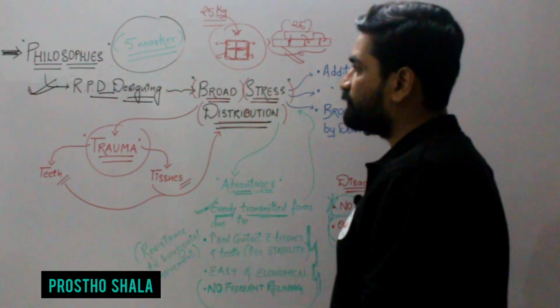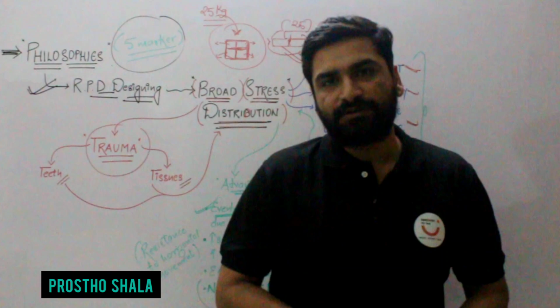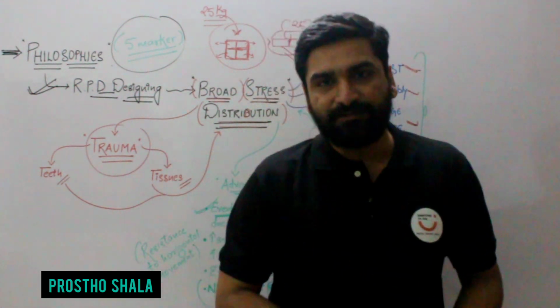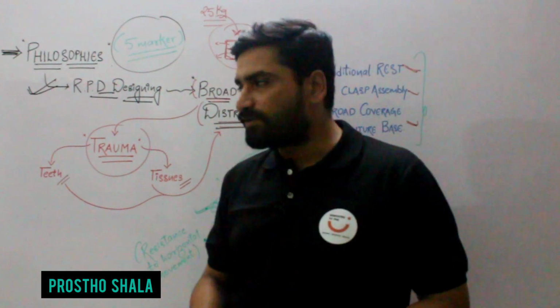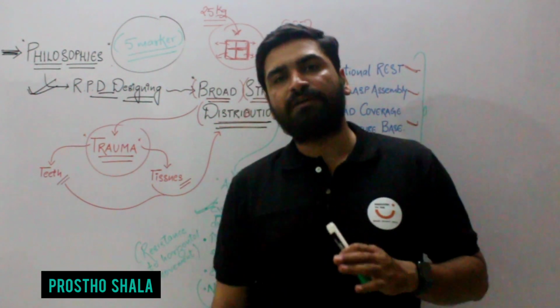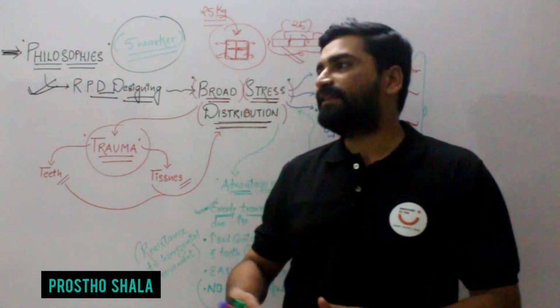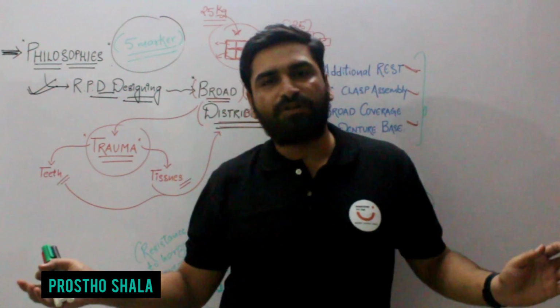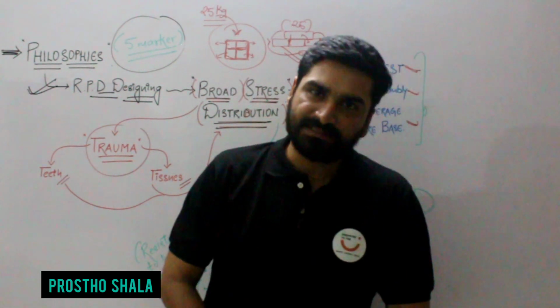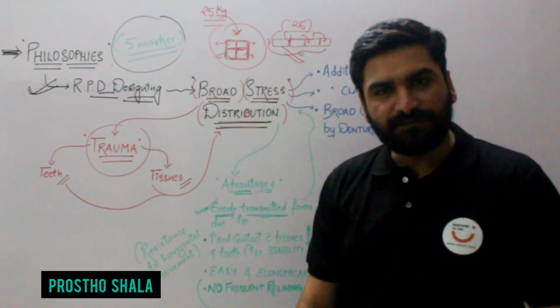Overall, starting with the conventional rigid design, broad stress distribution, stress equalization, any philosophy is going to work well if you are well aware of the situation in which you are using it. It is not that one philosophy is going to be used overall. There might be cases where you have to give a conventional rigid design, and cases where you have to go with a broad stress distribution philosophy.